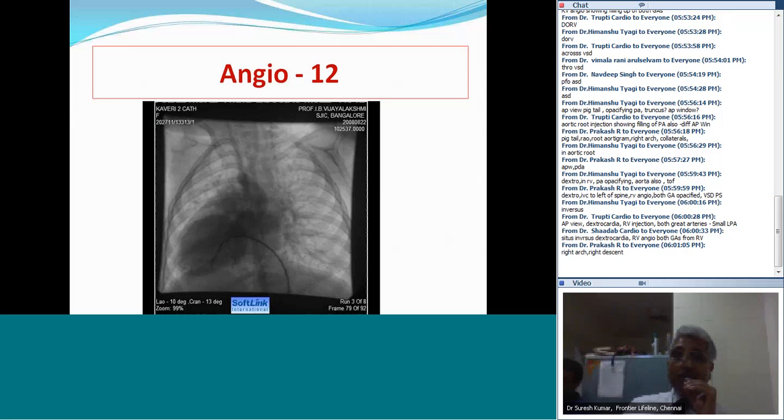Therefore, we said it is situs inversus dextrocardia. It is injection into the smooth walled left-sided ventricle, which means the ventricle failed to get inverted in a situs inversus, or it is an IDD, which is CTGA. You saw the restrictive VSD, you saw pulmonary stenosis, and you noted the pigtail catheter marking the aortic valve right and anterior to the pulmonary valve. It's a complex heart disease, but something which you can identify by following segmental anatomy correctly. Any question on this? I'll give you a minute to think and ask questions.